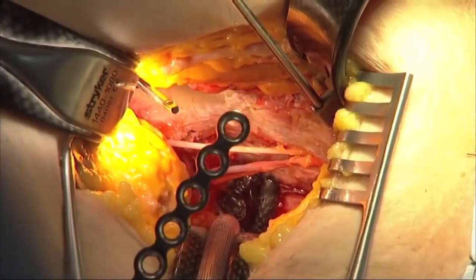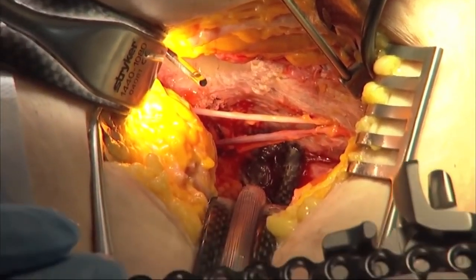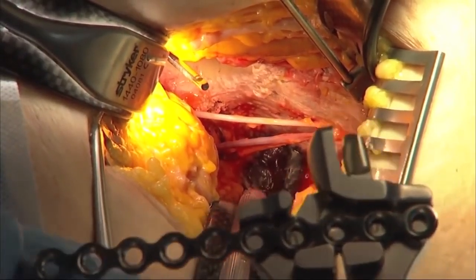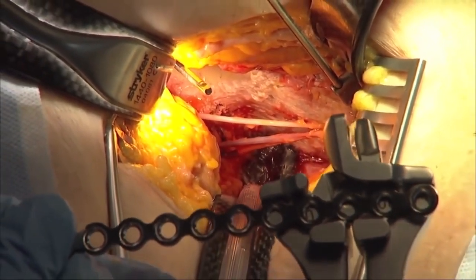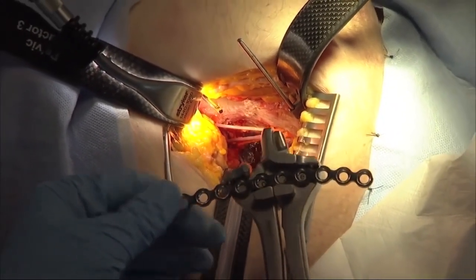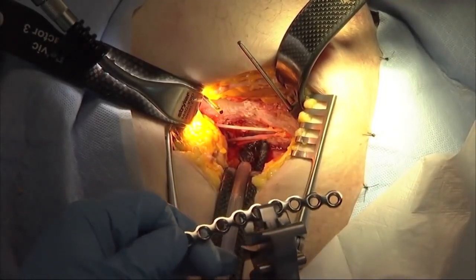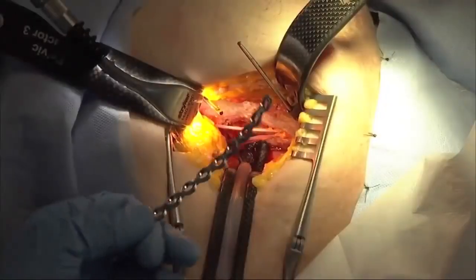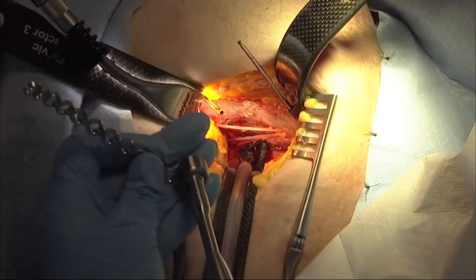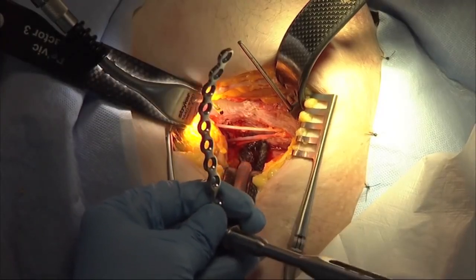Now we're going to show you plate contouring. And this is something else we've improved upon with this new plate bender. In general terms, there are three types of bends that we put on a plate. First, we have the side-to-side curve of the bend, which is demonstrated here. And that's usually the first one that should be performed. The second one is the hills and the valleys, or the flexion extension of the plate, which is demonstrated like that. And then finally, the third bend in the plate is the twist, to change the contour to match the relative topography of the pelvis.